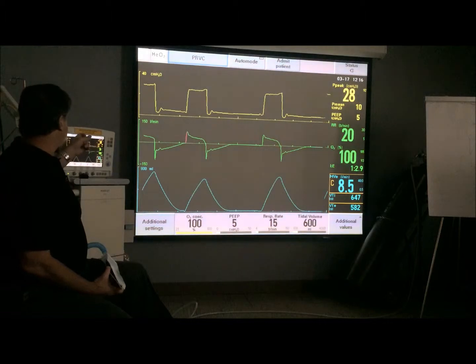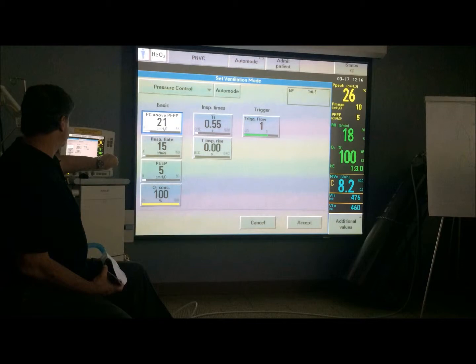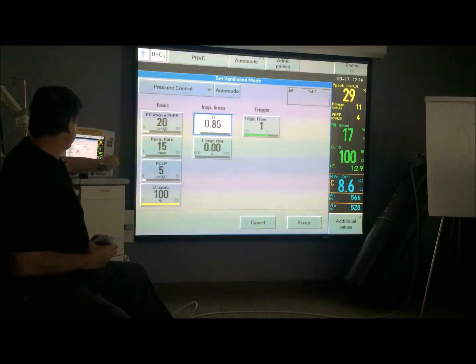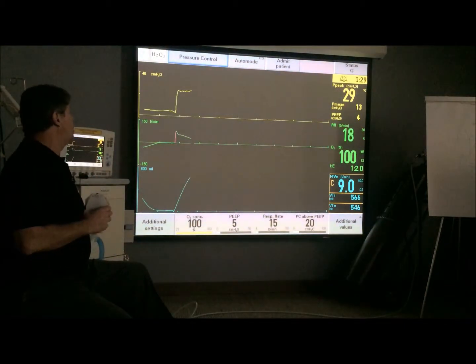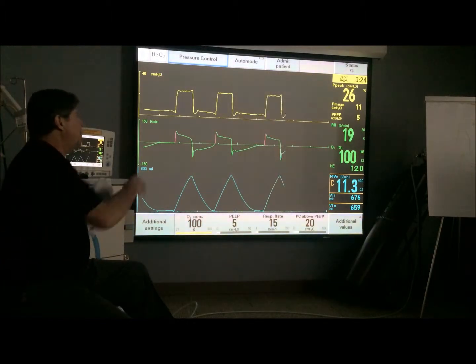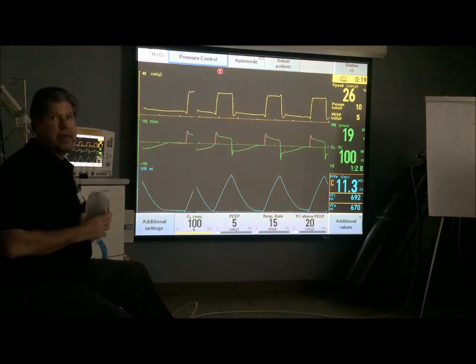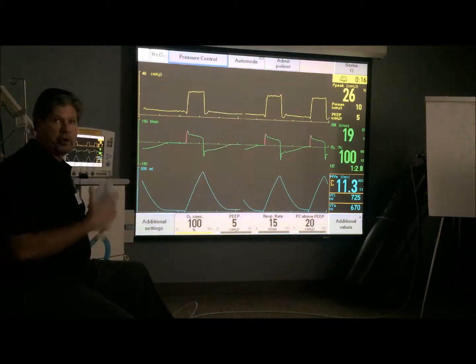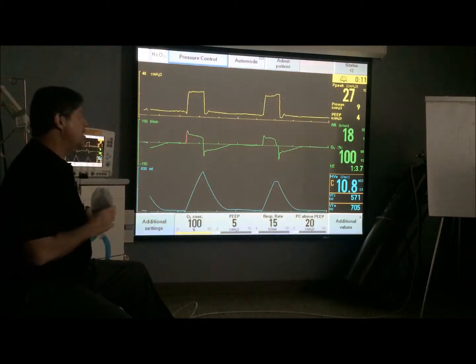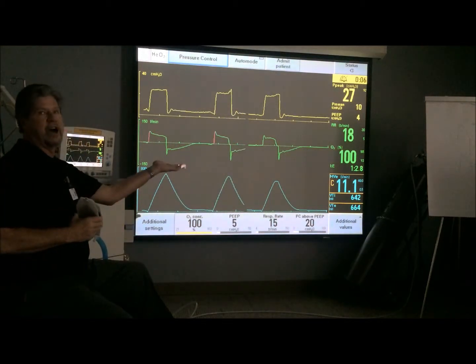Or simply go back to the mode of pressure control, where you set a constant pressure that the ventilator is not going to regulate from. And the patient now can get whatever flow and volume he wants on each and every breath. Now the problem with pressure control is the fact that although he can get whatever he wants, he may be getting a greater volume than what's ordered, and you have to explain to the doctor, well, he was struggling. His blood pressure was up, he was struggling when he was in PRVC because you wanted a low tidal volume, but he wants this volume.